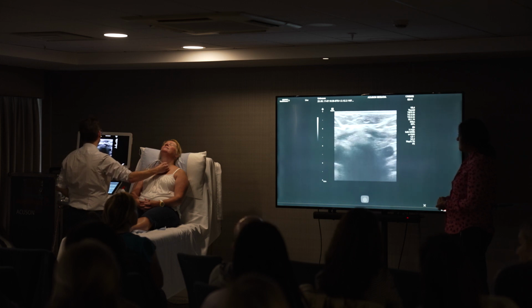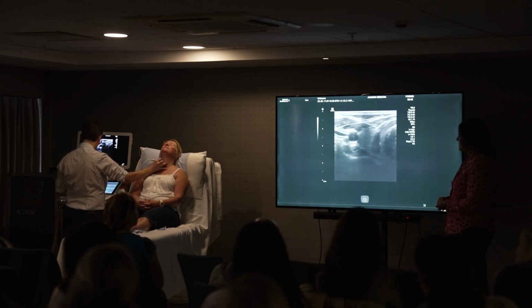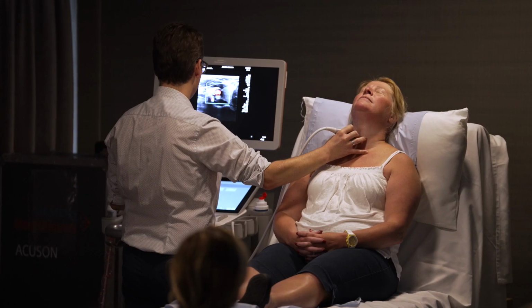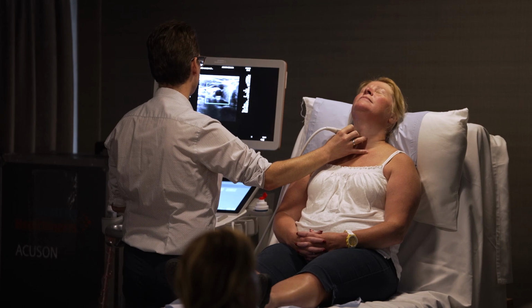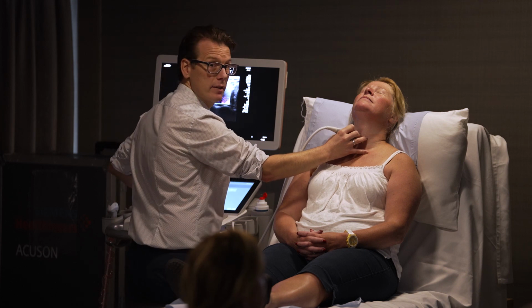Once we've done that, look at the thyroid. On this machine, it's the C button that you hit, depress, and it'll bring up a box for you. Then you can twist it either left or right: left to reduce the gain, and right to increase it. You can see how, if the gain is too high, you can make it flare.